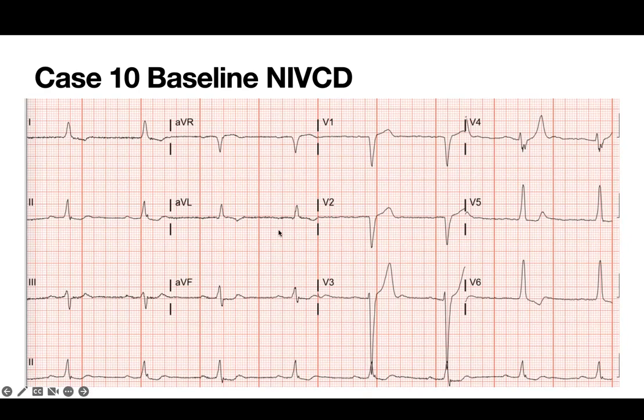I don't know if people agree with that, but going in, when you see a V5 and V6 like this at the baseline of the patient, I was thinking if I can get the same thing as what the patient has, that's the best I can probably hope for. And I said, there's no way I'm going to get LVAT 80, 90 in this kind of case.